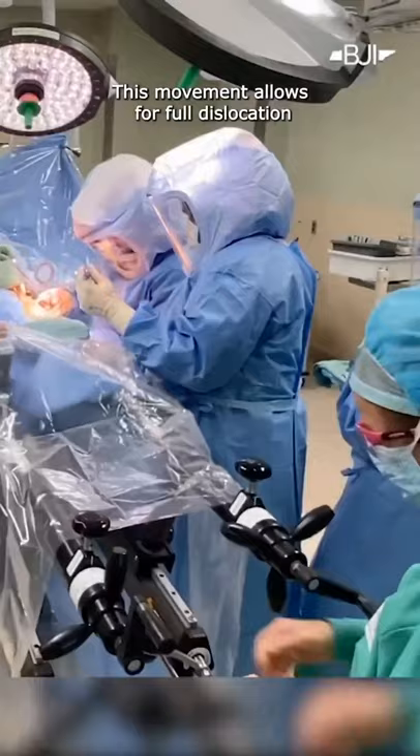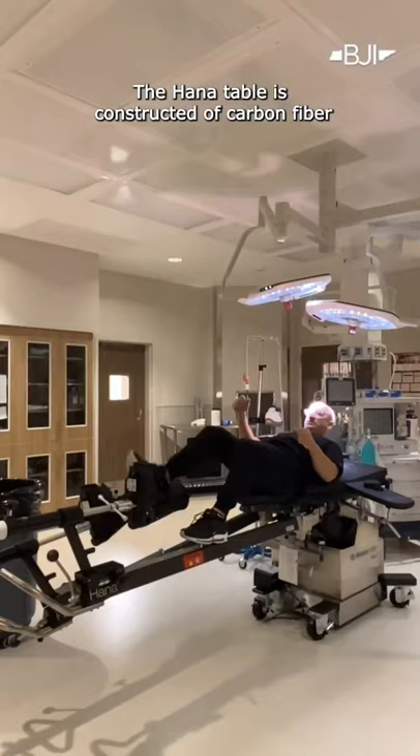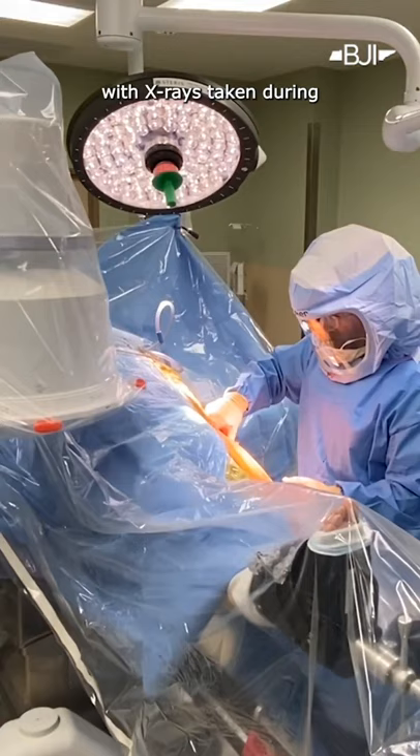This movement allows for full dislocation of the hip joint to optimize visualization of the hip socket and femur. The HANA table is constructed of carbon fiber, supporting up to 450 pounds. It's kind of comfortable and doesn't interfere with x-rays taken during hip replacement surgery.